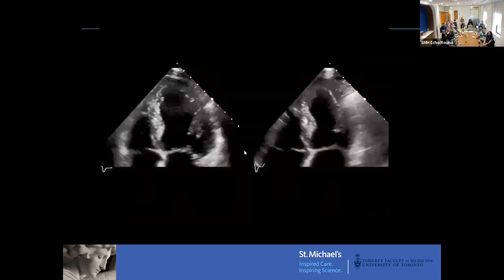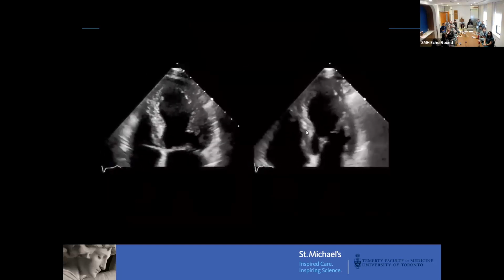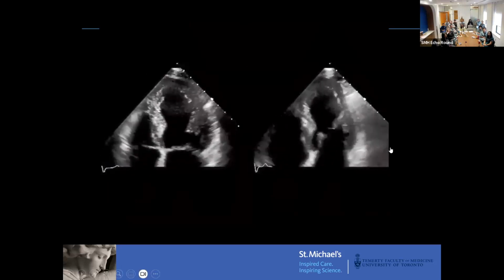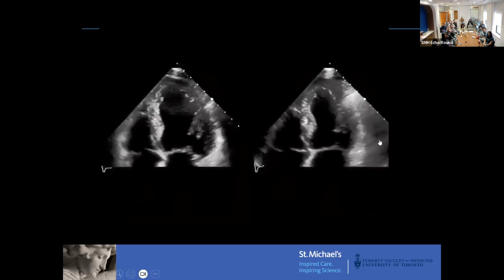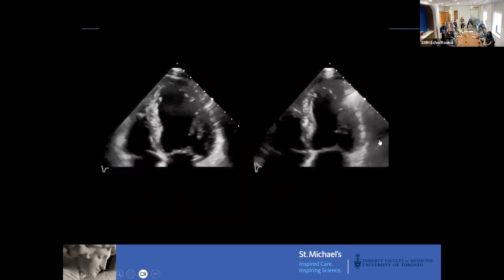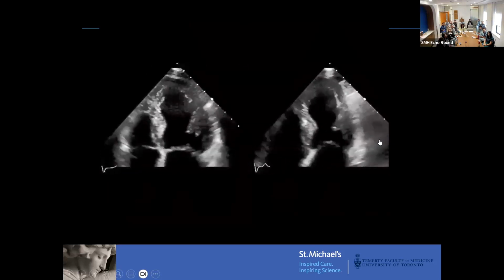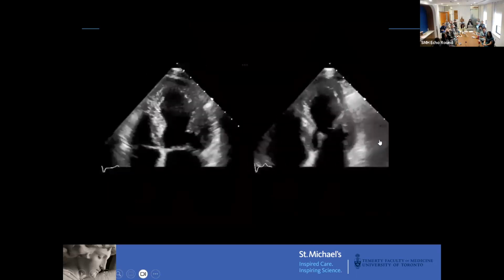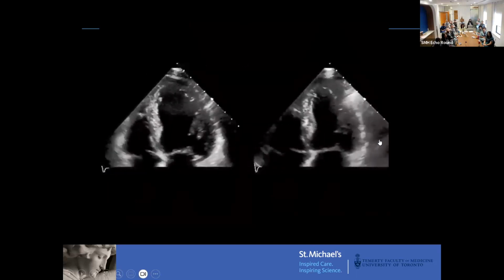This is a patient who actually has a left bundle at baseline, and so you can see that septum is desynchronous. I'll keep hitting the play, and Dr. Chow is pointing it out. But in this case, you can see that at peak stress, there is a little bit of thickening, but not nearly as much as you would expect. And this patient did end up having ischemia. But still helpful to know that difference there.